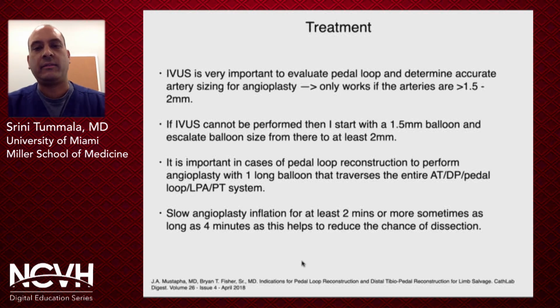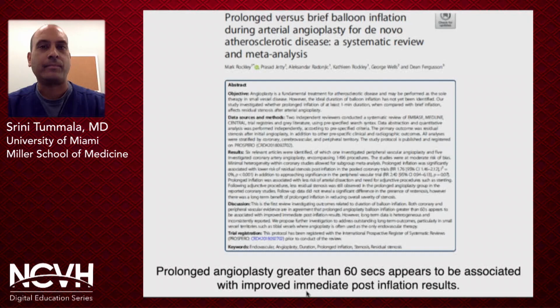Remember, it's important in cases of pedal loop reconstruction to perform angioplasty with one long balloon that traverses the entire pedal loop, up into the AT as well as up into the posterior tibial artery. And you want to perform that angioplasty slowly and keep it inflated for at least 2 minutes, and sometimes as long as 4 minutes, as this helps reduce the chance for dissections. And here's some data regarding that.